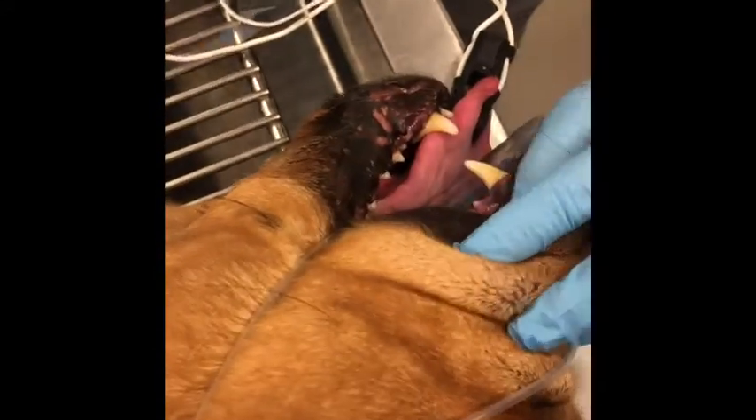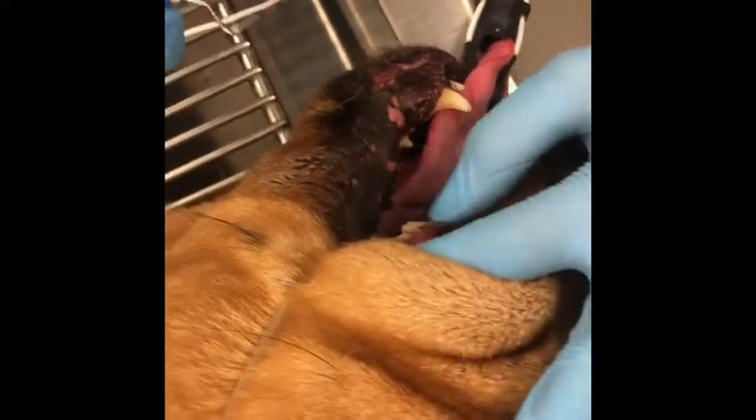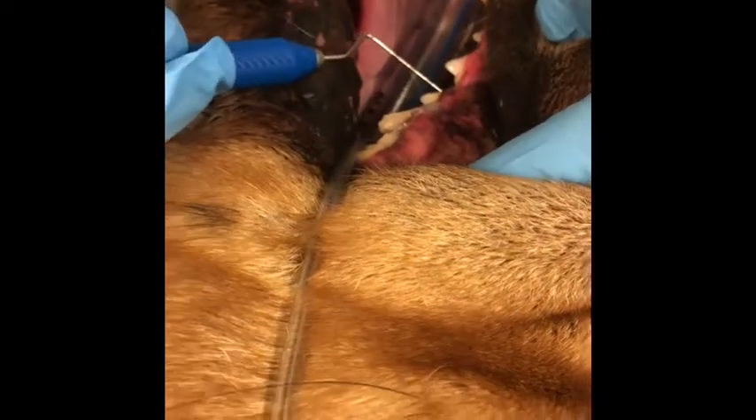Before we get started with our cleaning, we're just going to look through the mouth real quick. It looks like he does have an issue with one of his teeth that we're going to evaluate on our dental x-rays first. But we're going to do a good once-over before we start cleaning.